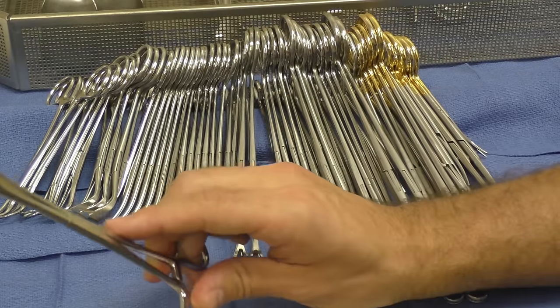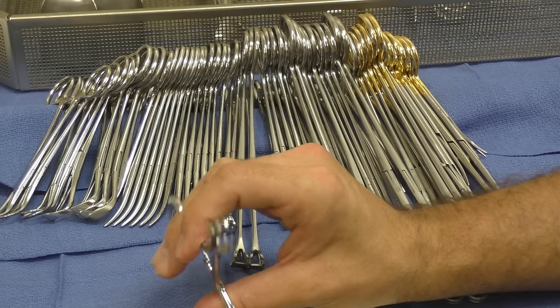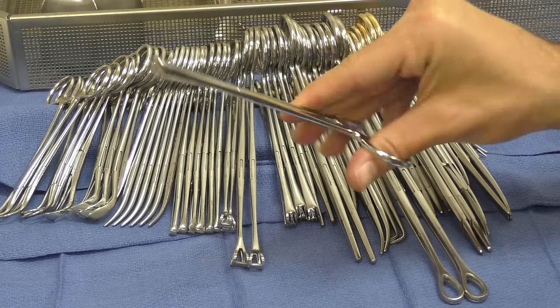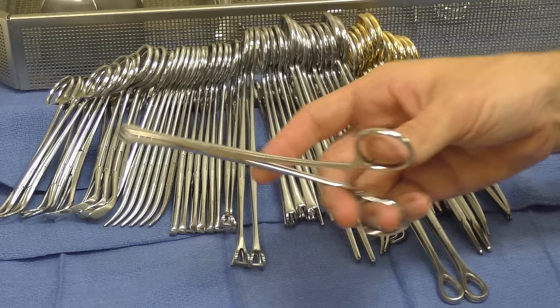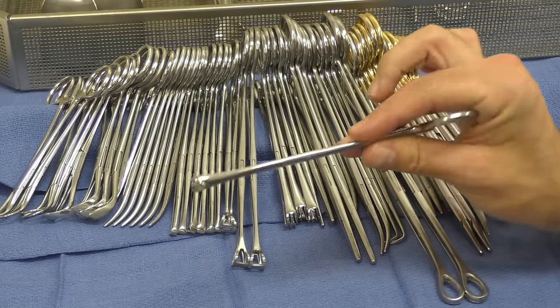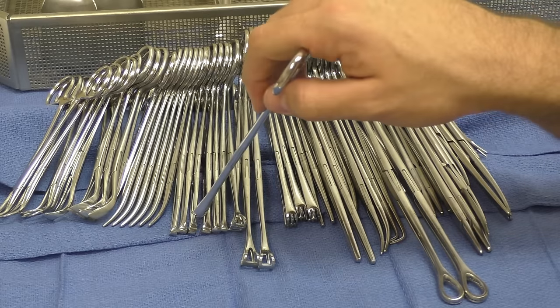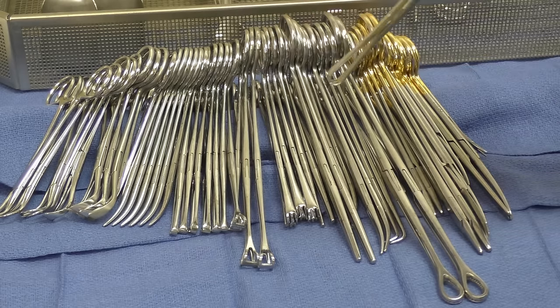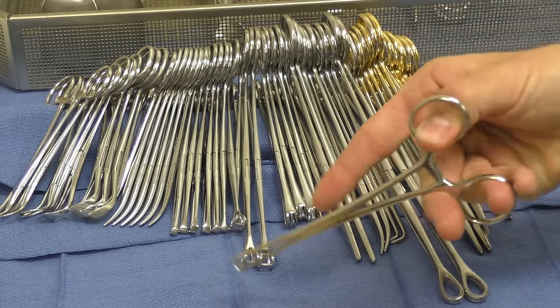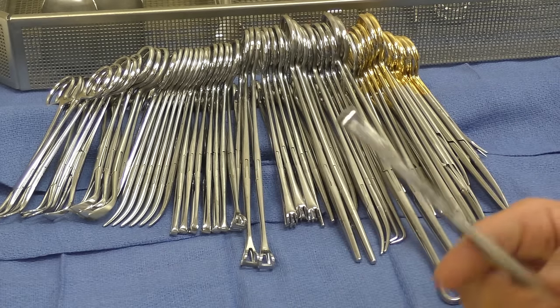Now we have something traumatic here. This is the Lahey clamp, or the Lahey goiter clamp, I believe they call the real name of it. Obviously you can see it has teeth. It's very sharp. Similar use to Babcock and Allis, where it's going to be grabbing tissue and holding on to it. They will not use this on bowel like a Babcock would be used on, but maybe in surgeries where an Allis is used and the Allis just keeps slipping off of the tissue and isn't grasping on there properly, they might ask for a Lahey so they could really grab onto that tissue and tug on it so they can get their full dissection in that they want to achieve.